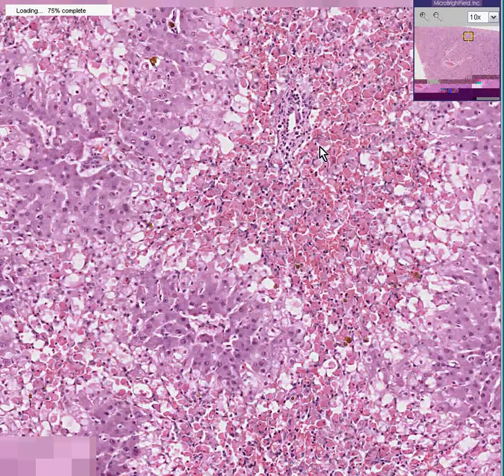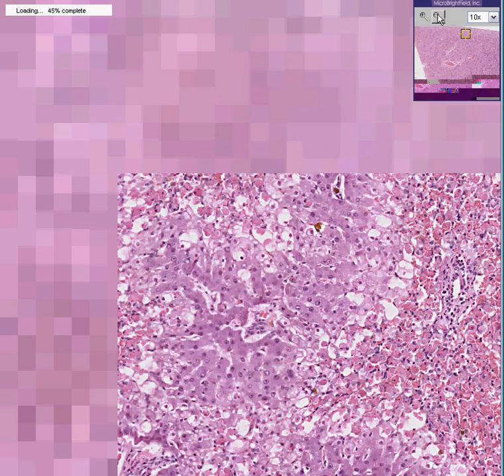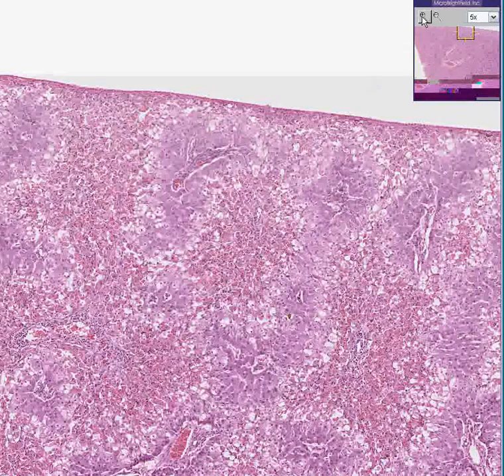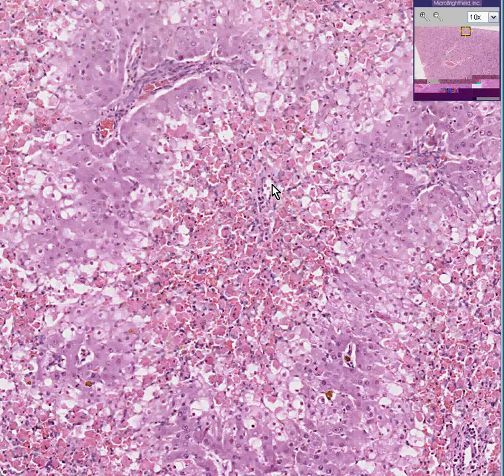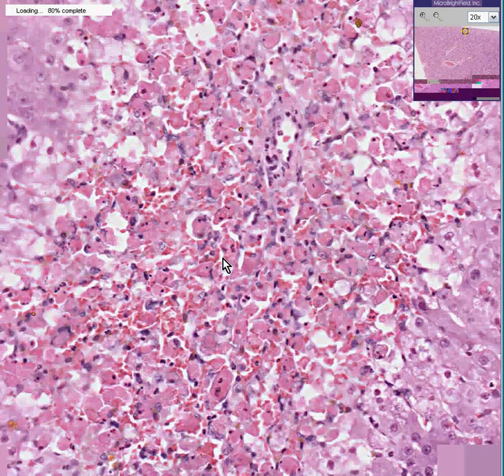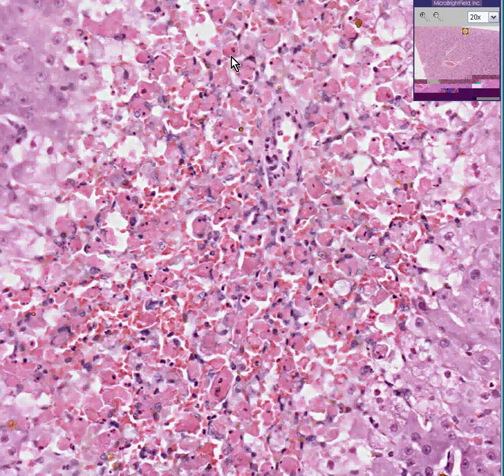The areas where you see relatively preserved tissue are closer to the portal areas where you can see portal veins and parts of bile ducts and hepatic arteries. The parts that are wiped out — like here — are the central portions of the lobule. There may have been a residual central vein in here at one time, but I'm not sure because the whole central portion of the lobule is necrotic — i.e., central lobular necrosis. These are relatively viable hepatocytes looking exactly the way they should, and these remnants of cells in here, hardly able to make out nuclei anymore, are necrotic hepatocytes.